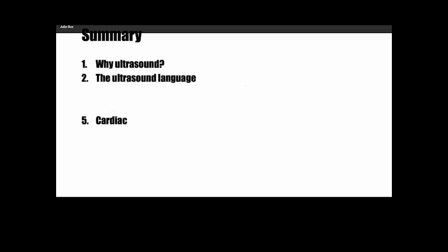All right, so in summary, today we talked about why we wanna do ultrasound in the pre-hospital setting. We talked about the ABCs of ultrasound. So hopefully this lecture will get you started with your ultrasound skills, and make sure that you do lots and lots of practice. And one advice I could give is that, learn what normal looks like. And that's how you catch abnormals, right? You have to know what normals look like before you catch all the weird ones. So do lots and lots of practice on each other.